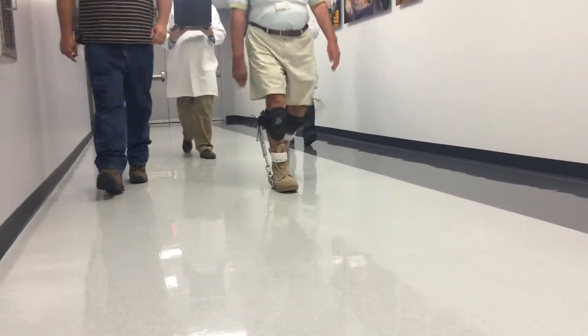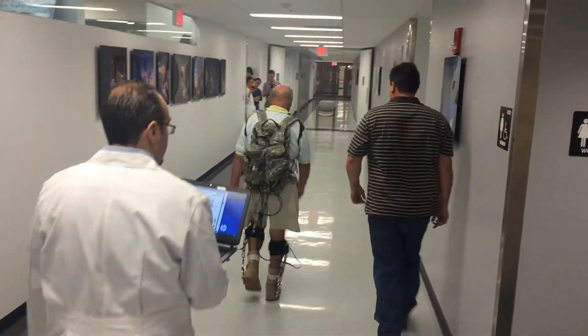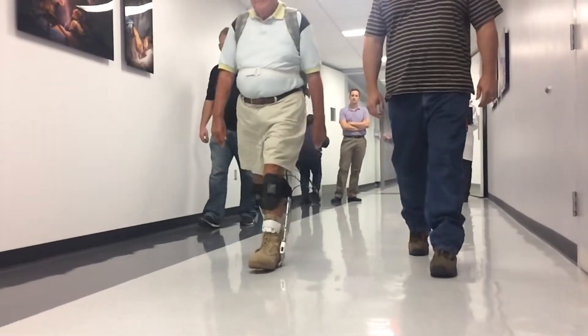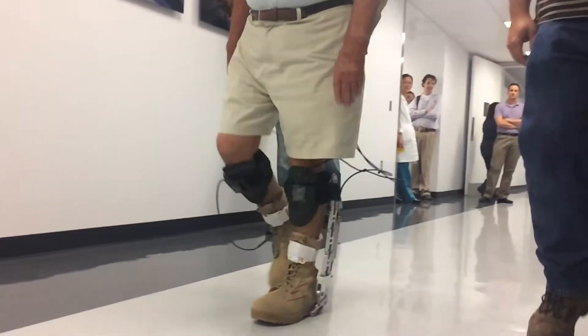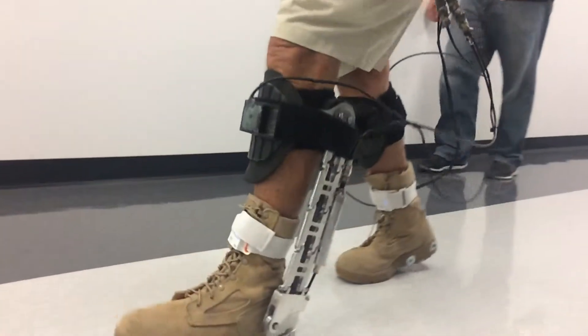This is still more of a prototype, but you can see this gentleman is able to get up and walk relatively quickly. He noted that it was somewhat light, and despite the increased weight you would imagine, the strength and leverage that this wearable robot provides allows him to walk a lot faster. Here in slow motion you can see his gait really isn't affected in any adverse way, more so than just the normal decay process with aging and balance.